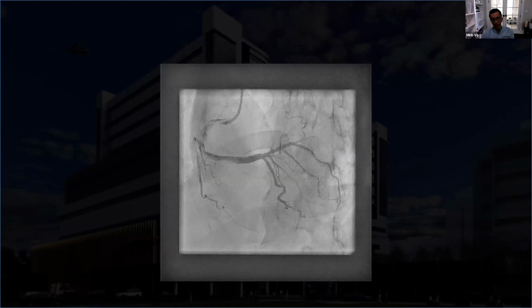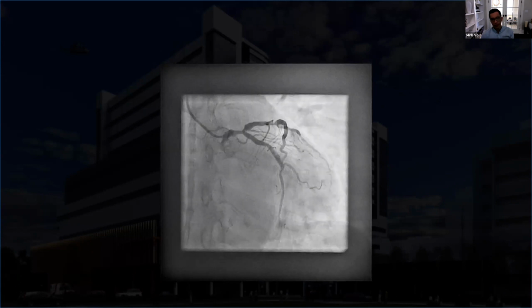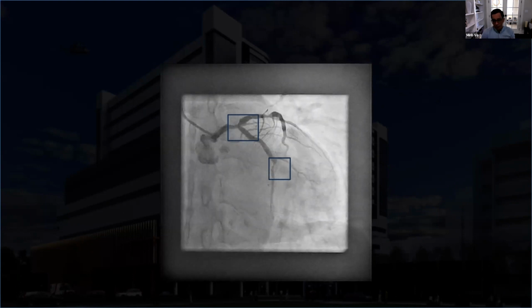So this is a non-STEMI patient, admitted to hospital. Again, because of COVID, and especially the third wave, they really want this patient home. That's the right side. Then I look at the left. Angiographically, it looks horrific. You have the left main bifurcation and the mid left circumflex severe lesion. Now I'm scratching my head, and I'm a complex operator. This is my area of passion, so I really wanted to proceed with complex left main stenting. Surgery wouldn't offer it, again because of the pandemic, shorter beds, ICU is full.